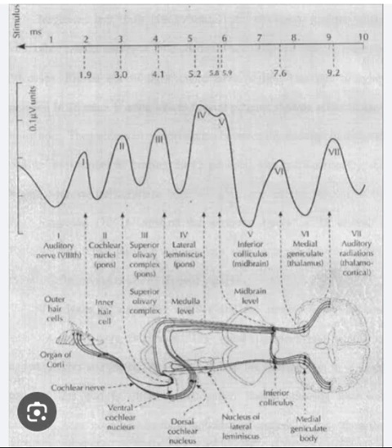The test involves placing electrodes on the scalp to record the brain's electrical activity in response to auditory stimuli, often presented as clicks or tones. This recorded neural response is meticulously analyzed to identify distinct waves that correspond to different stages of auditory processing in the brainstem. By examining the latencies and amplitudes of these waves, clinicians can pinpoint the presence and location of abnormalities, shedding light on the nature and extent of hearing impairments, nerve dysfunctions, and even subtle brainstem lesions.